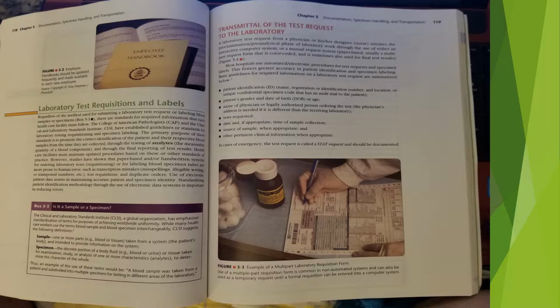The College of American Pathologists, or CAP, and the Clinical and Laboratory Standards Institute, or CLSI, have established guidelines or standards for laboratory testing, requisitioning, and specimen labeling. The primary purpose of these standards is to promote the correct identification of the patient and their respective blood samples from the time they are collected, through the testing of analytes, the measurable quantity of blood component, and through the final reporting of test results.